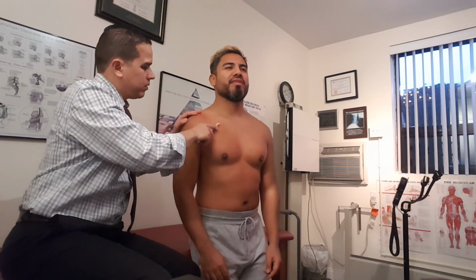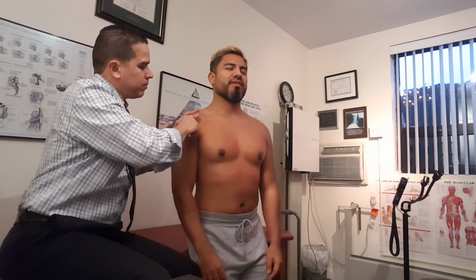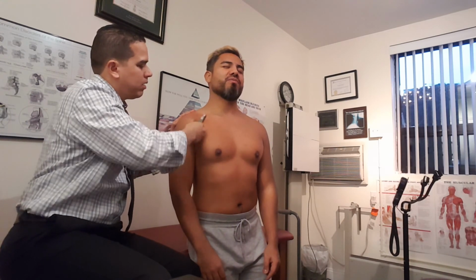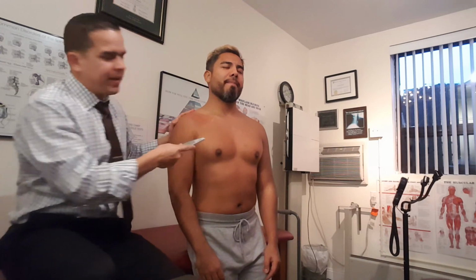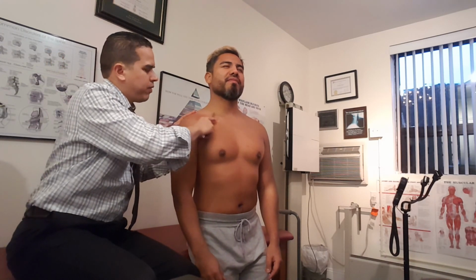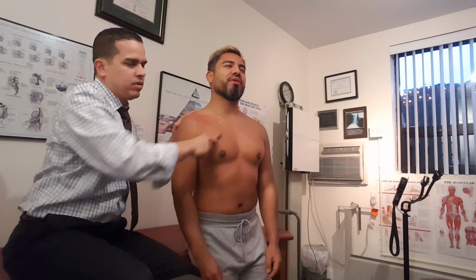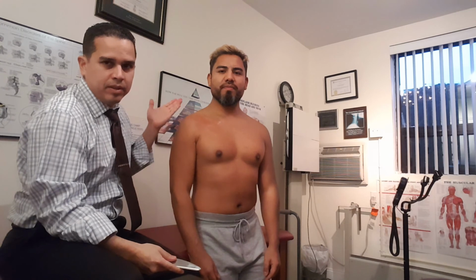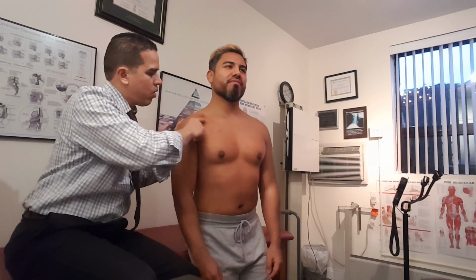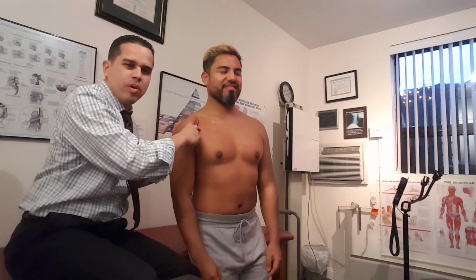Okay. It's right there, doctor. Right there. It's somewhere in between where you end and where you start. So I'm going to go through here. I'm just going to get a general feel of how the tissue is feeling from the first time. So I don't feel anything right there. Nothing. The first time, this was all red, all across in here. This tissue is back to its normal state. But it's right there, doctor, right? There's a little point, and this is why we're going to do pressure points.